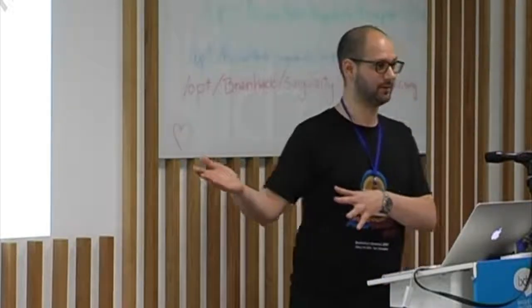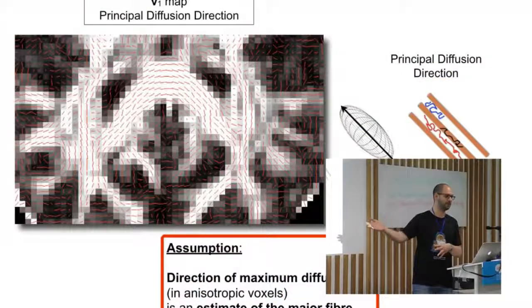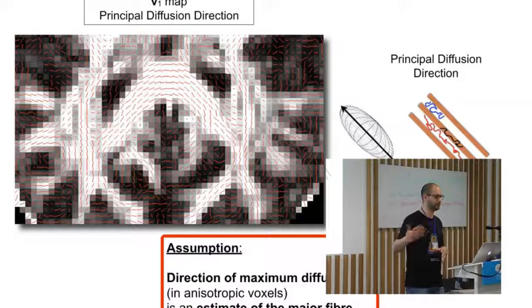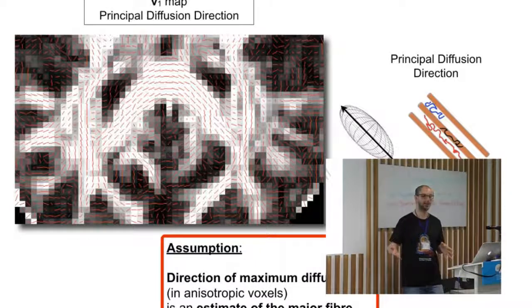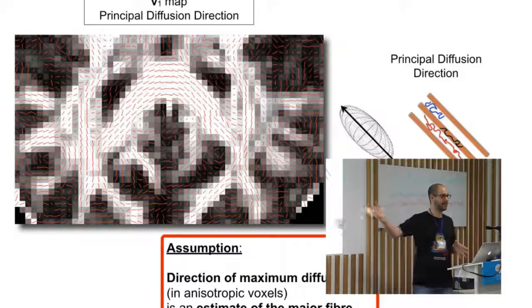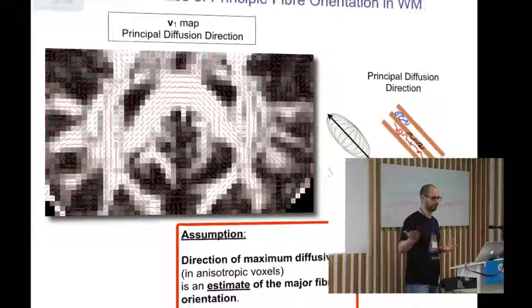Now to start, let's go back to a very small single slide recap of what we can do with a diffusion tensor model. Basically we can get pictures like this, right? So we can fit into each and every voxel our nice tensor. We can derive the principal diffusion direction using the diagonalization that I described before, and based on the assumption, once again, that water molecules diffusion correspond to axonal orientation, we can fit those kind of images, and we can use them to do tractography.